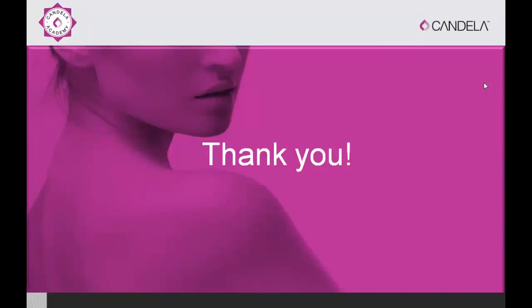There's a question about a maximum of 4 passes with both. Well, it depends on what you're treating. For fine lines, wrinkles, and acne scarring, you want a minimum of around 4 passes. If you are going to combine the 1064 and the 532, I would probably do 3 passes of the 1064 and 2 passes of the 532.